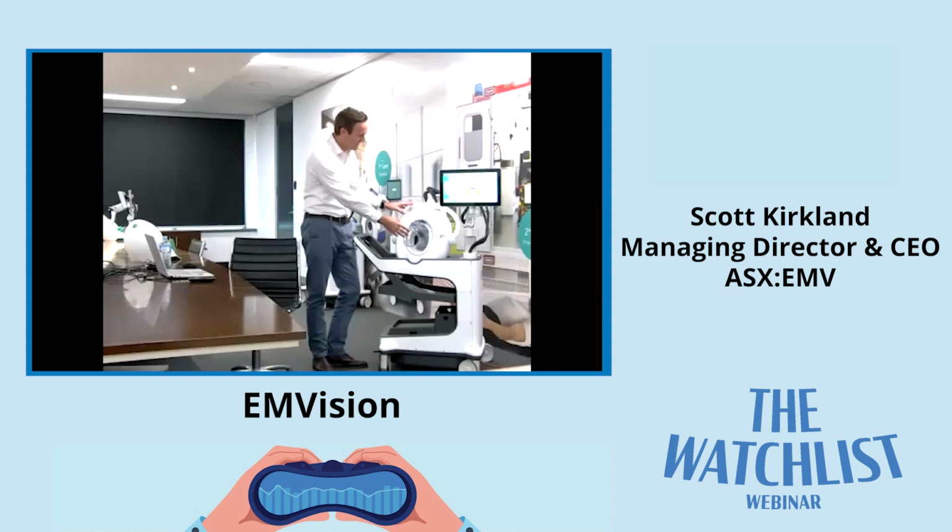It's not in any way claustrophobic like an MRI can be for many people, and is non-invasive. So once the system is fully inflated, the scan itself is very, very quick. We'll run through the scan now.